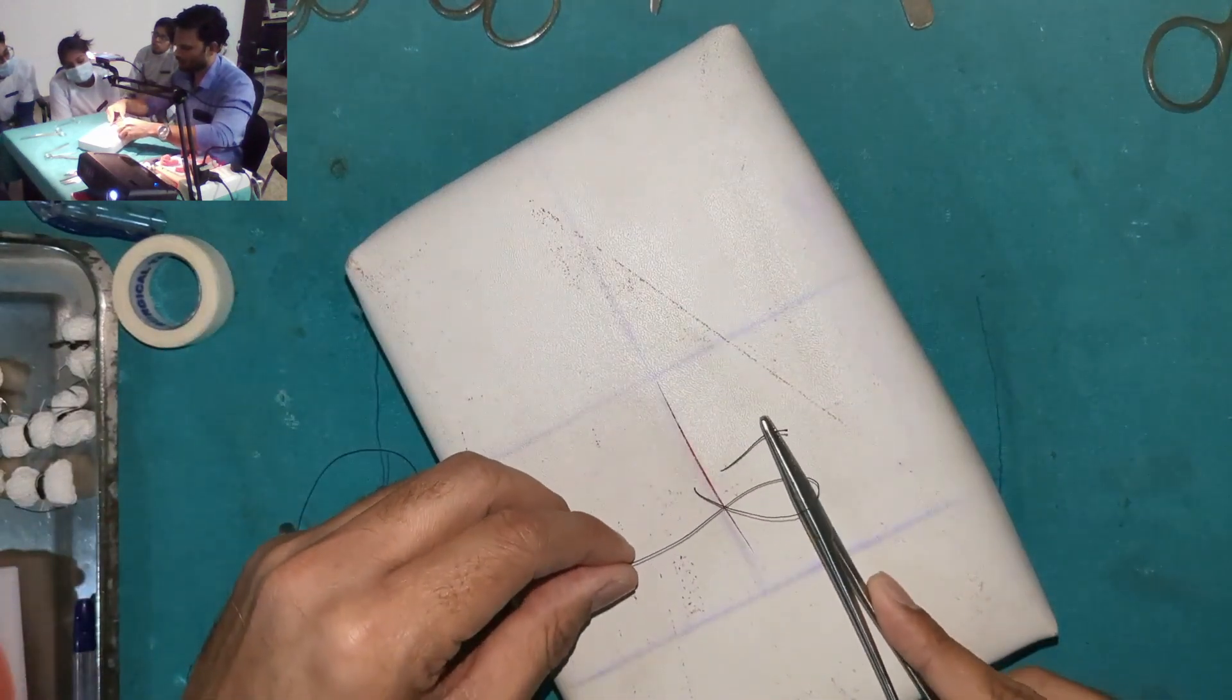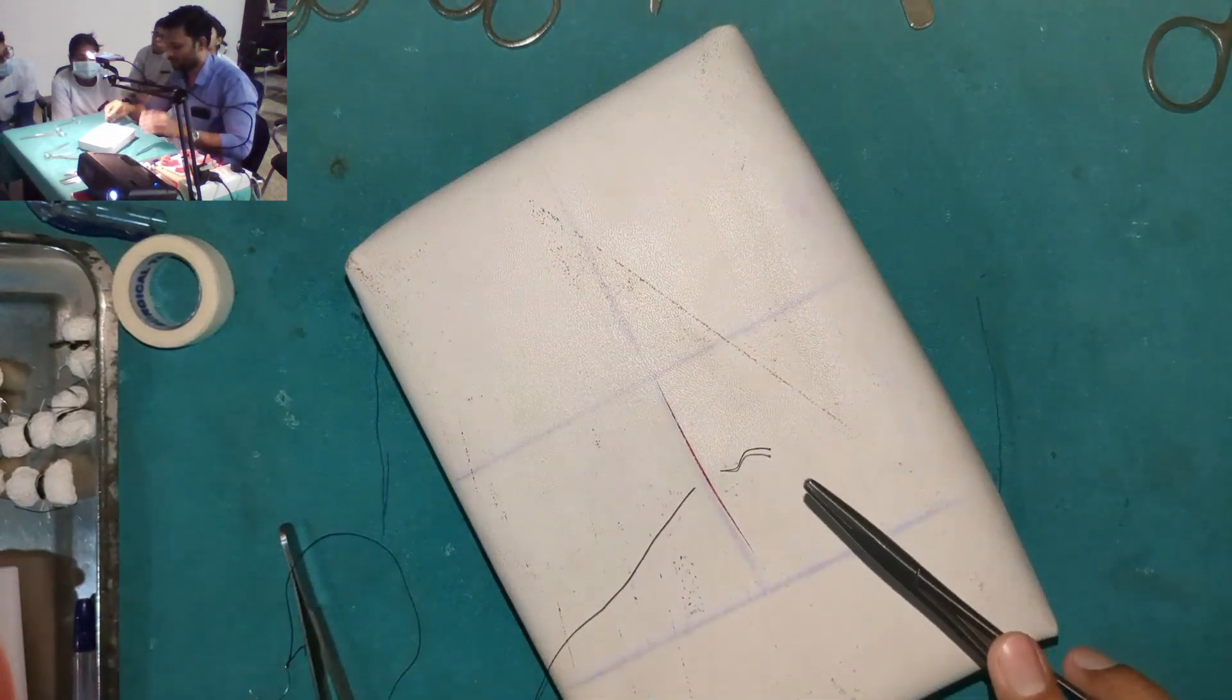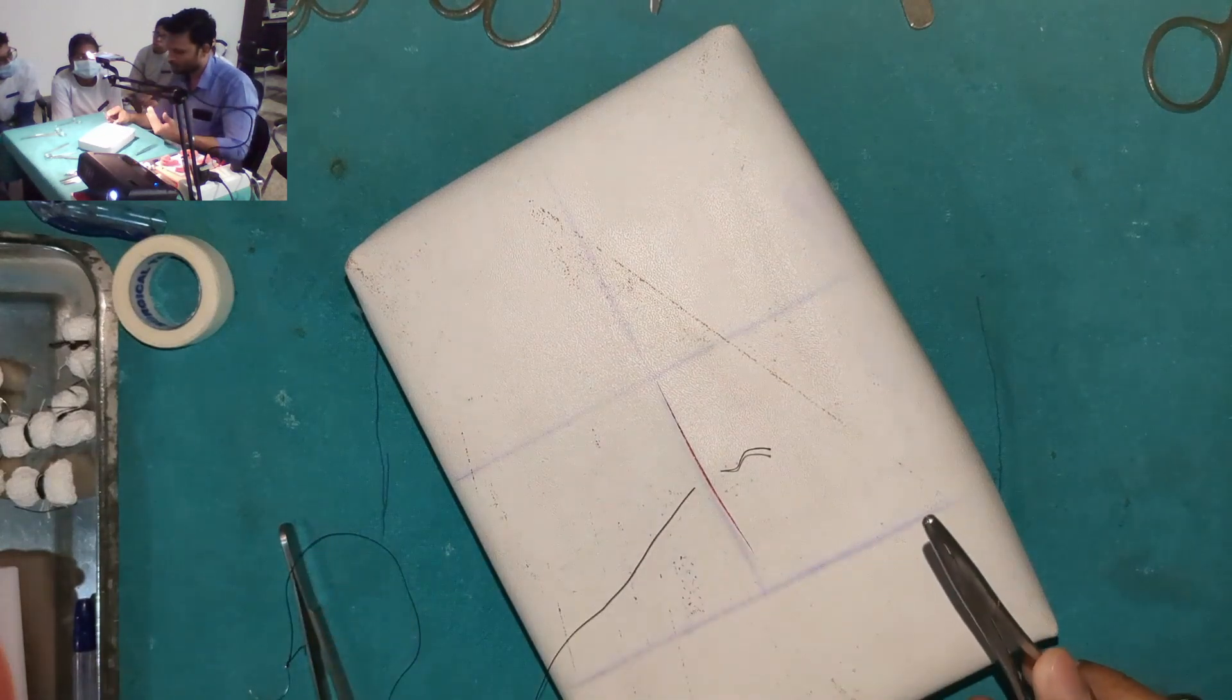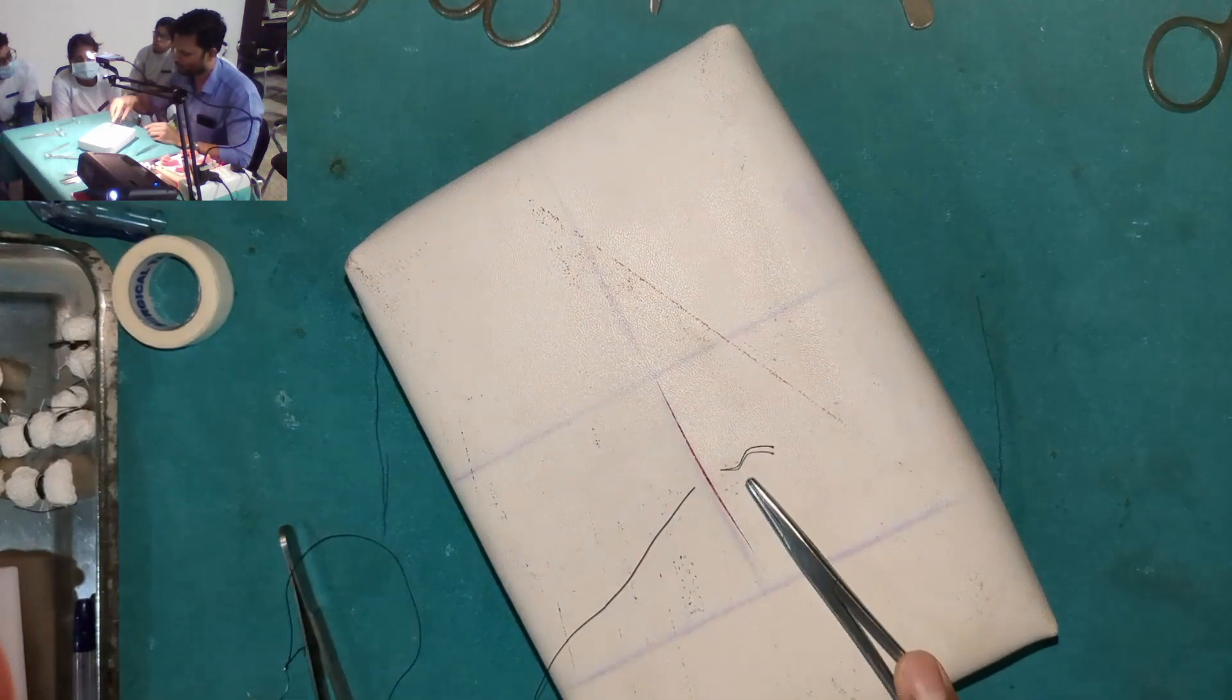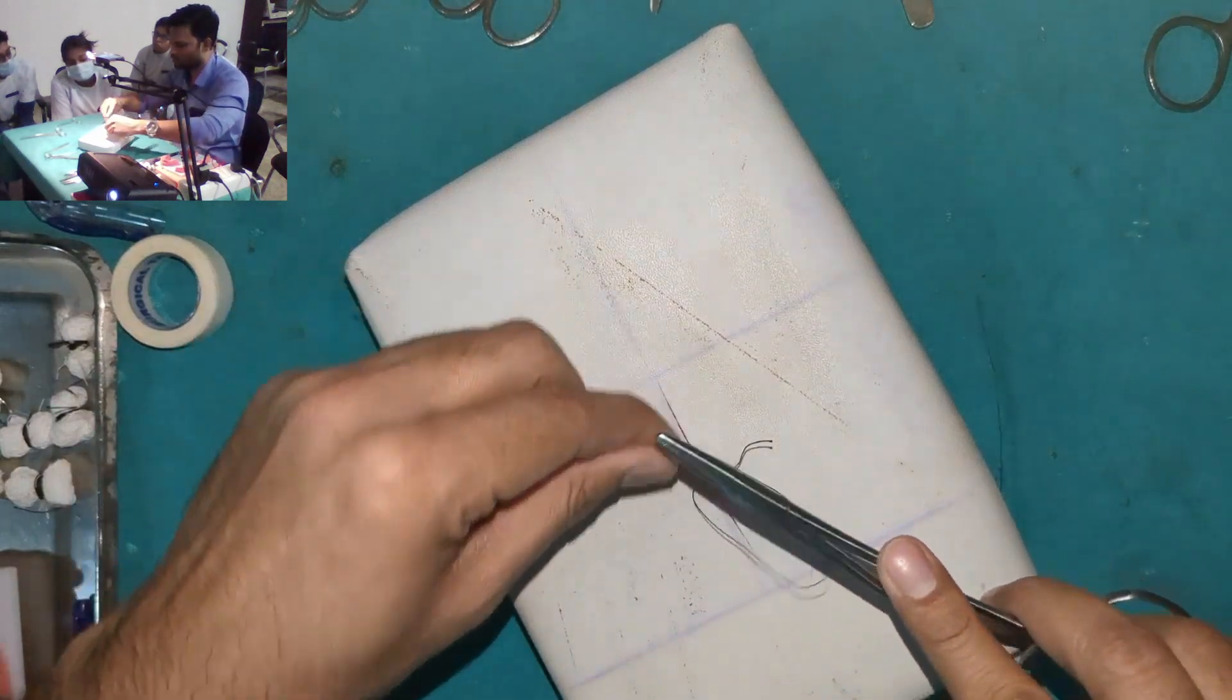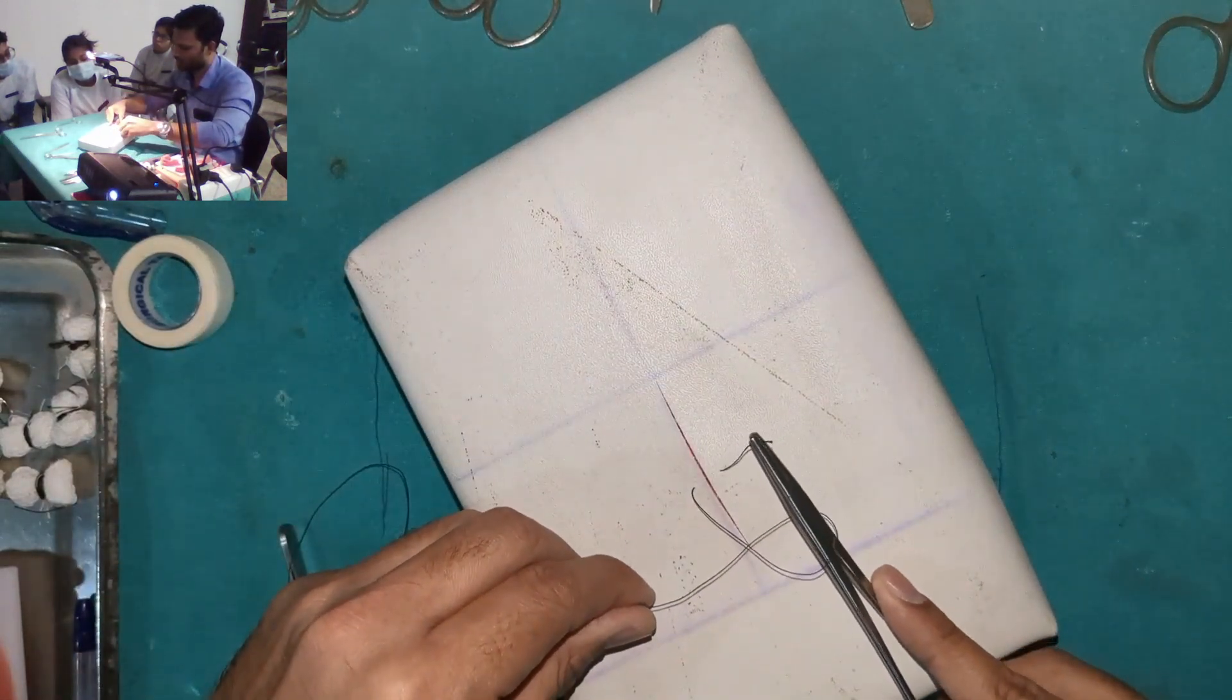So one throw, I'll hold it, and remember this, wherever you take the first bite, the knot ideally should go on that side. So here I took the first bite. So I throw this, I hold this.